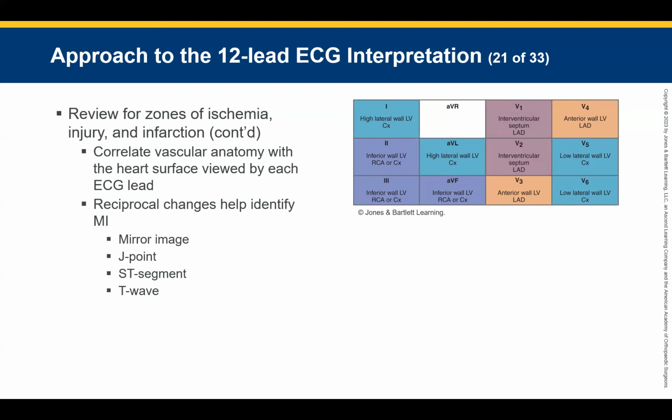So we gotta know this. We gotta know all the leads ass backwards. We're skipping AVR for now. At some point in our advanced portion of cardiology, we'll come back to AVR. This isn't even advanced, guys. This is still basics. Oh my God. So we hit this page right here, our base rhythms. We hit all of our base rhythms, and now we are on the sprinkles, and we need 12 leads for sure.